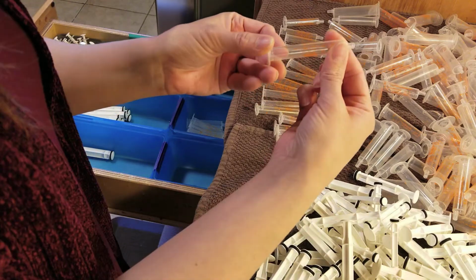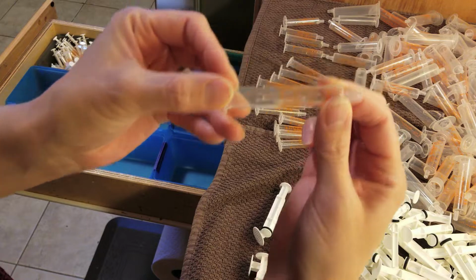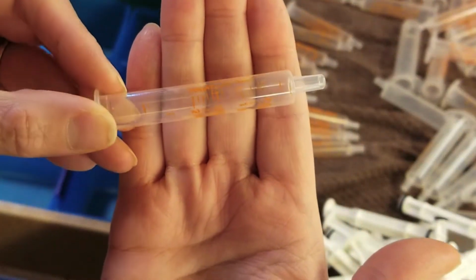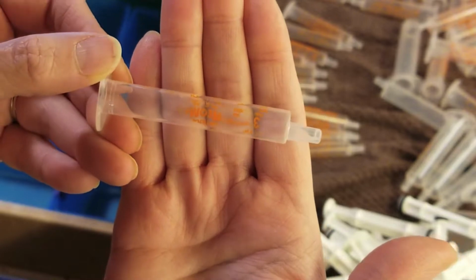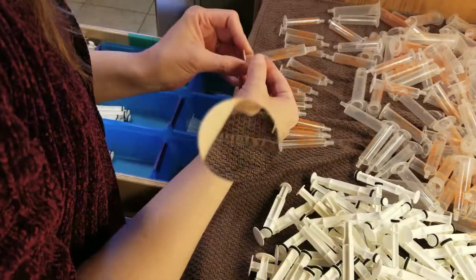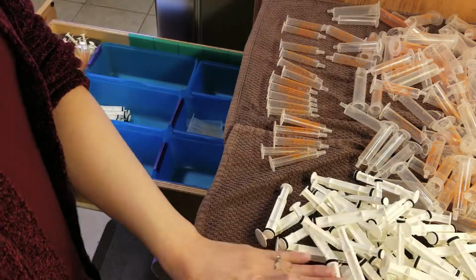Part of the process is I check to make sure the markings are still readable. If it's not readable, then you can't draw a liquid medication with it. There are some of the larger syringes that we'll use either for water flushes or for tablets. Markings are not required for tablet medication since you're not drawing it like you would a liquid medication.